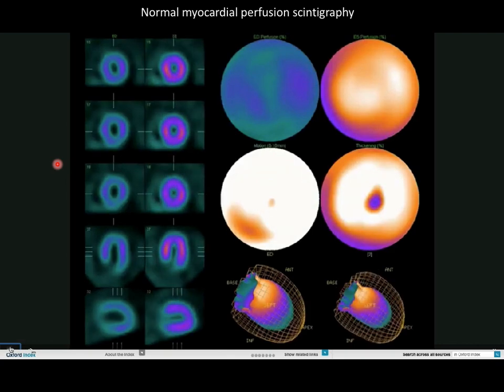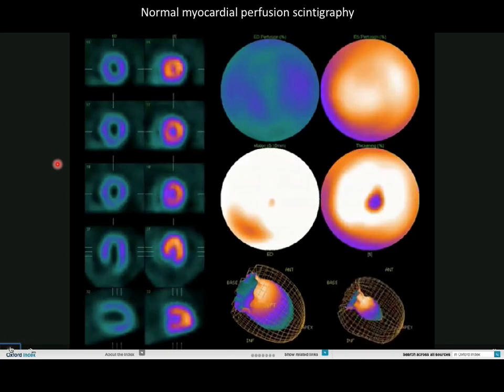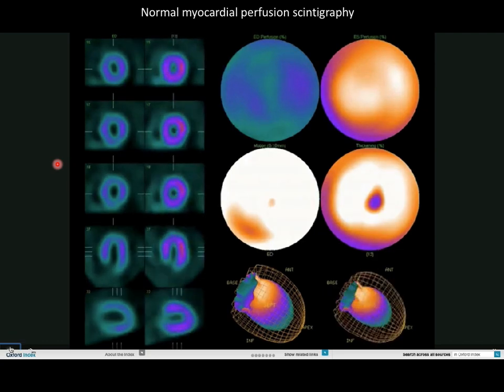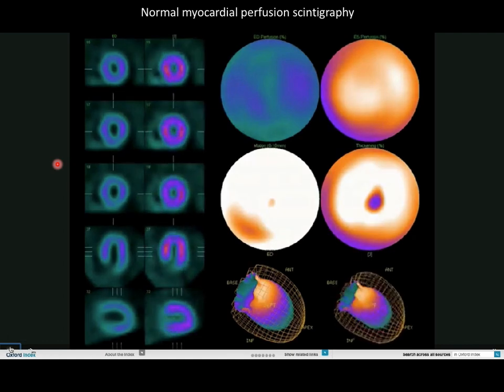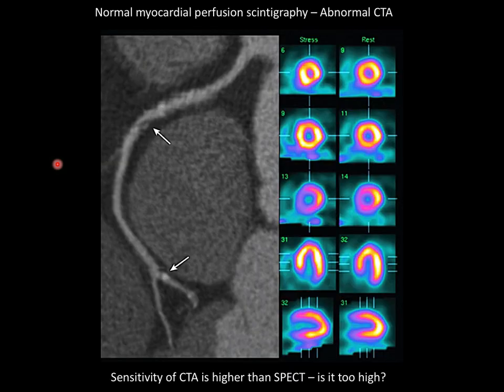However, I've had 3 friends who had absolutely normal SPECT scans, and they had pretty severe coronary disease. So my N of my friends is not good. So the data, when you look at like a whole population of people, would indicate that this is a good test to get a good negative predictive value, a good positive predictive value. My data shows otherwise, but anyway, and we'll see in the paper I'll look at today that it doesn't seem to be that good.